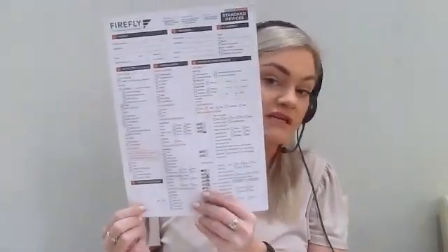If there's ever anything that you're unsure of, you can put a question mark on it, or in the special instructions, you can write down here, please call to discuss, and we'll happily go through it with you. As well as that, if there's a top cover or a bottom cover, if there's anything that you're unsure of, you can always write down here, please phone to discuss, and we'll happily give you a call to make sure that you're okay with what you're receiving.